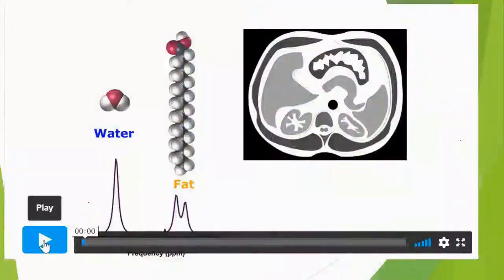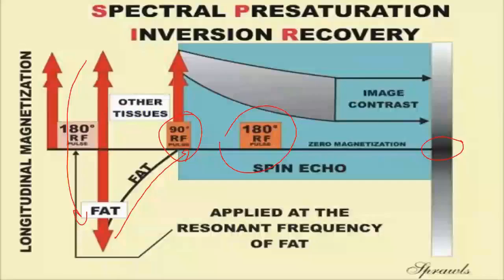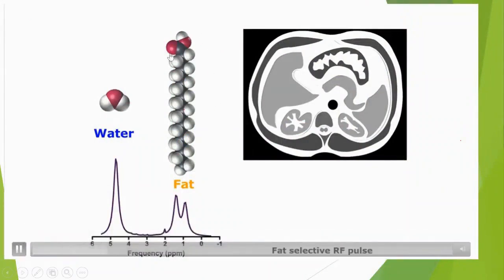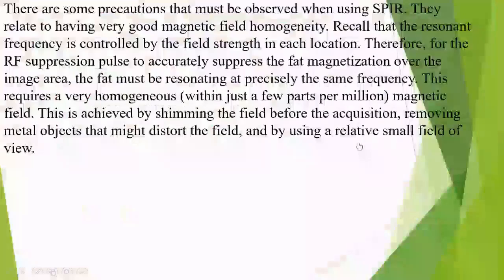If we take another look at the image, the whole area is entirely illuminated. This is before you do your process. Ultimately, this is approximately how it works. You worked on the fat and you reduced it completely. So now you have brought it down to 0 and your image appeared like this.